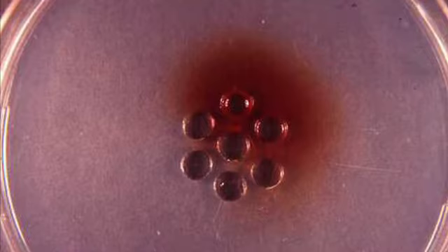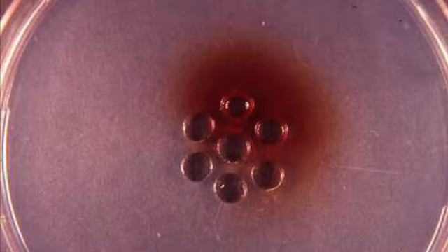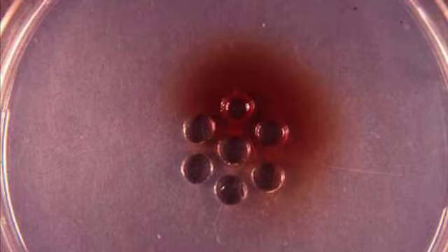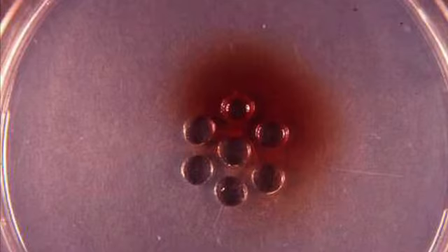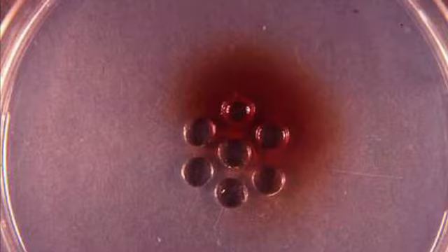So if you had, say, 5 or 6 samples that you want to test, you would put the antibody, the serum, in the middle hole here, and the suspected animal blood, that is the blood from the scene, dissolved. You put that in the others.